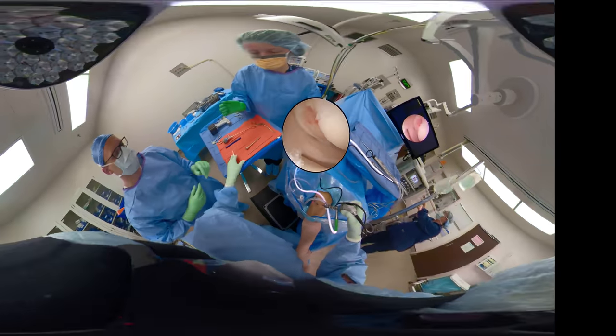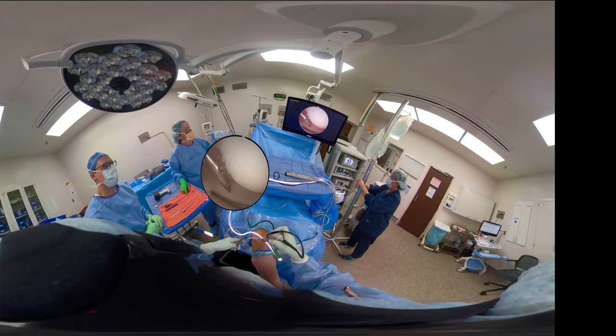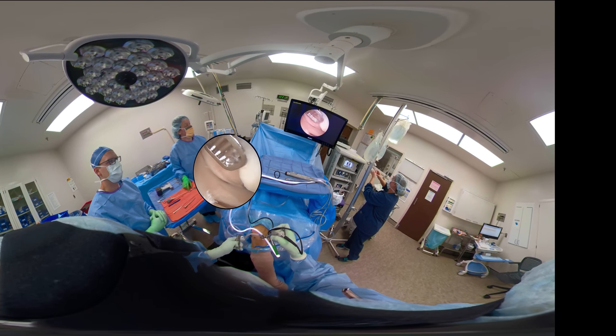The circulating nurse has gotten the water down low, the normal saline down low, so sometimes you might lose your distension in the joint. So if you do that and you have a red out, you've got to think you're out of water, or there isn't enough pressure, or the water is off for some reason.